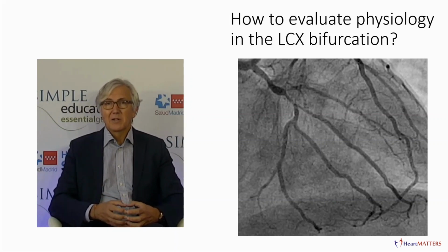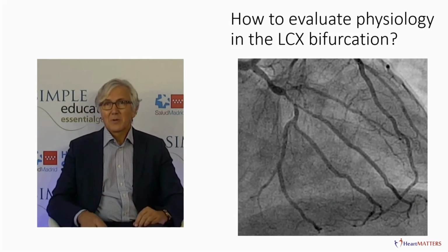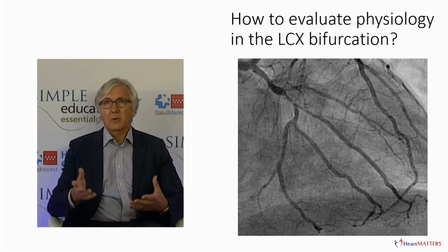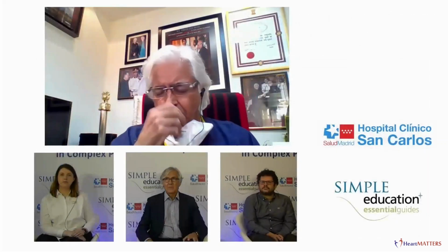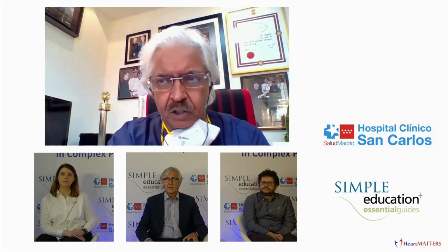Yes, we've been doing very complex lesions without physiology, but I think that has also shown us that we've overused stenting and relied less on aggressive medical therapy. That's what all the studies of physiology assessment have demonstrated to us. I think we've rationalized a lot now, and perhaps we are missing some very important lesions.